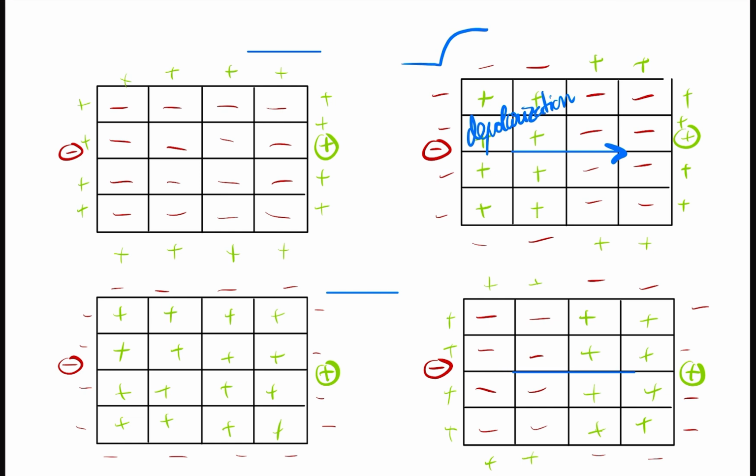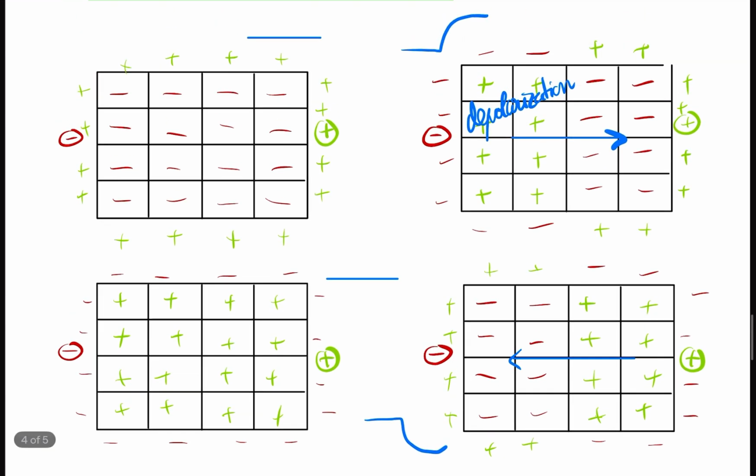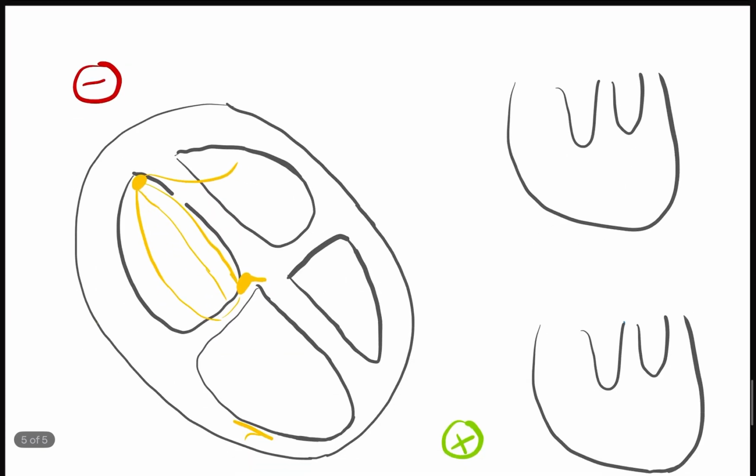How does the vector look here? Well, as you can see, we always go, I'm talking about what's inside now, from plus to minus. And we are going to focus on the electrodes here, the plus and minus, and we can see that it goes from plus to minus, which means that it's going to be negative under the main line, the wave. Okay?